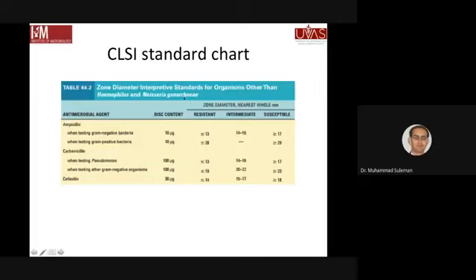के लिए table 44.2 में CLSI standard में there is a booklet that is published internationally. And for ampicillin, अगर आप example लें ampicillin की, ग्राम नेगेटिव बैक्टीरिया पे अगर एक एंटीबायोटिक डिस्क एम्पिसिलिन की 10 माइक्रोग्राम एंटीबायोटिक है उसमें, and the zone of inhibition is less than 13 millimeters, 13 मिलीमीटर से कम है, तो which means that particular बैक्टीरिया जो ग्राम नेगेटिव बैक्टीरिया आपकी प्लेट में है वो रेजिस्टेंट है एम्पिसिलिन से.